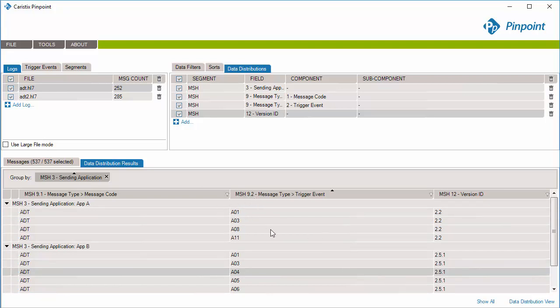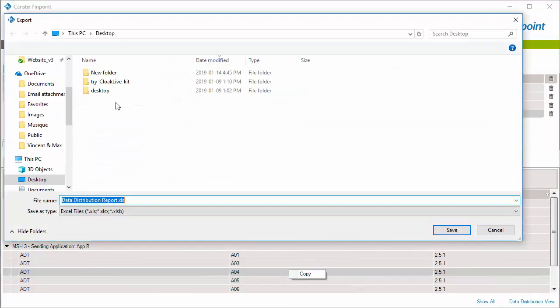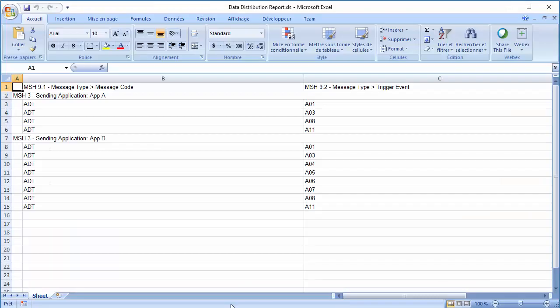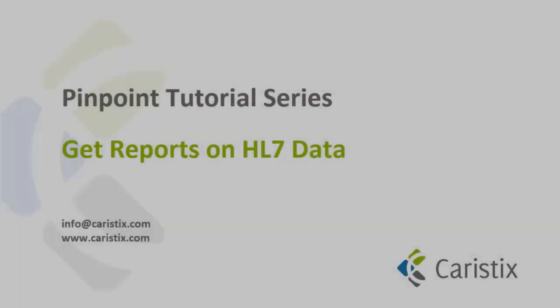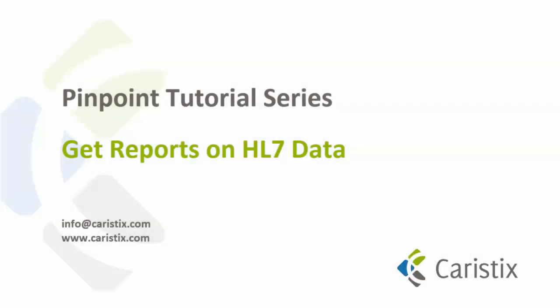You can sort your values if needed. When you're done editing, right-click in the Data Distribution Results tab and select Save Report. This will save this report as an Excel document. This ends the Get Report on HL7 Data Introduction tutorial.